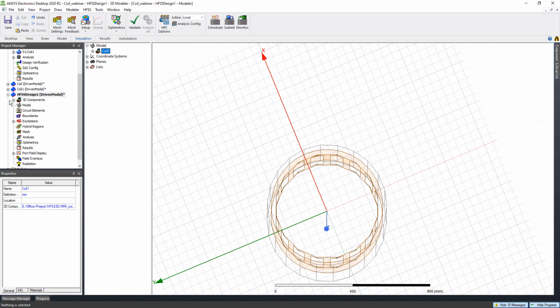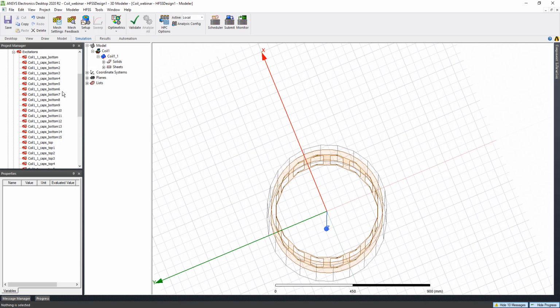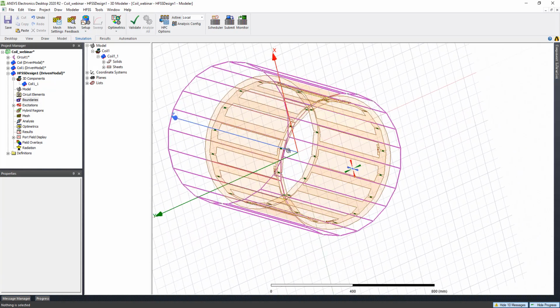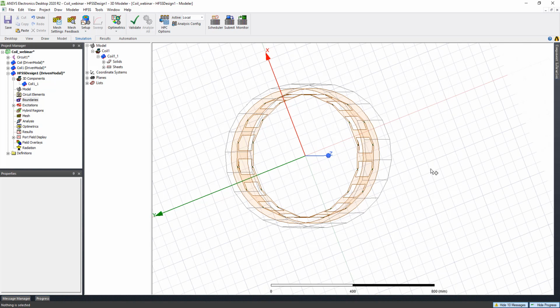So here you can see this is our 3D component, and it is listed under the 3D components here. And when you bring it over, you will also include all the excitation that you have defined. And next thing, oh yeah, I was telling you, we are not going to put a real human head or human body in this case. There are two types of human body that ANSYS has. One is just a very simple human body. So here in the component library, we have the human body extension. We have female or male, even though there's no really big difference for the arm and head. So we can just select a head with drag and drop.